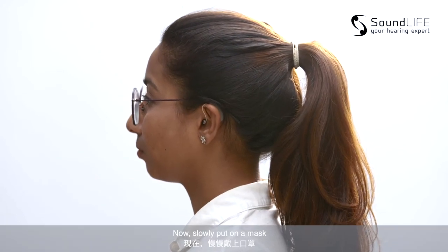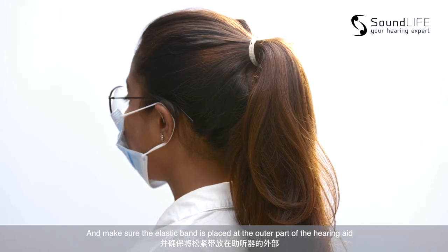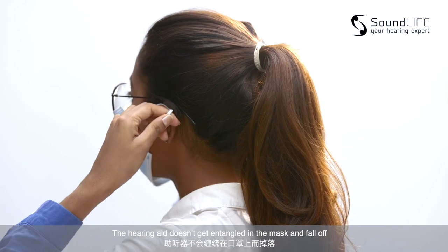Now, slowly put on a mask and make sure the elastic band is placed at the outer part of the hearing aid. So when you remove the mask, the hearing aid doesn't get entangled in the mask and fall off.